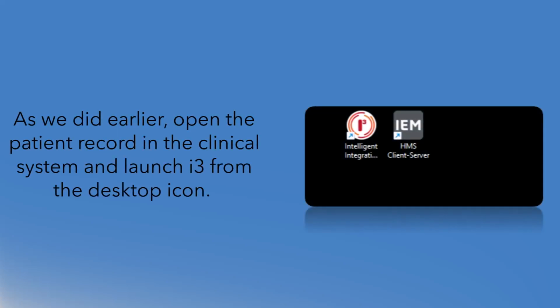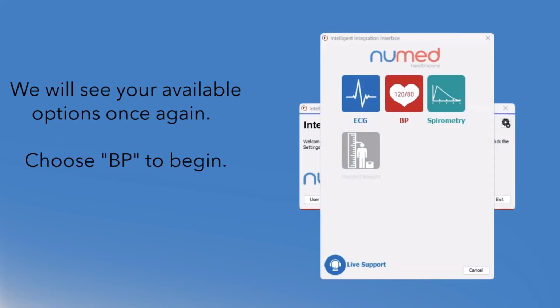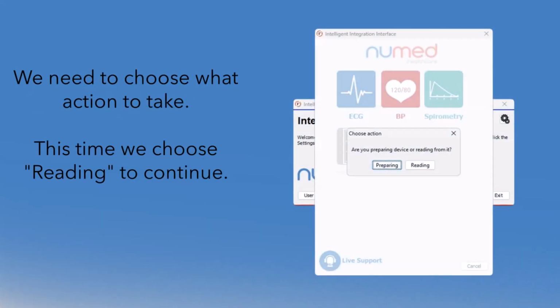As we did earlier, open the patient record in the clinical system and launch i3 from the desktop icon. Once the screen appears, simply select Start. We will see your available options once again. Choose the BP icon to begin. We need to choose what action to take. This time we choose Reading to continue.